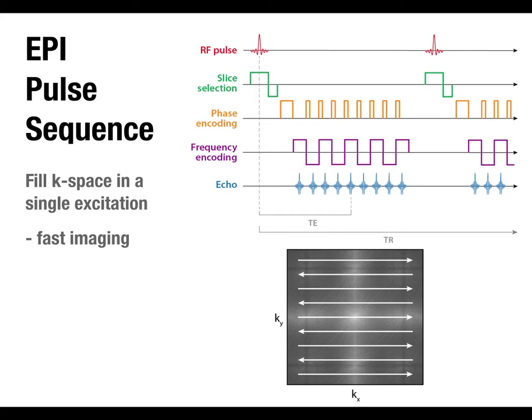With these EPI pulse sequences, if you ever have an fMRI scan, one thing they will tell you is don't put your hands together like this. That's because when you do that, you're creating a closed loop. And these rapidly switching gradients can actually induce an electrical current. Again, right-hand rule. It wouldn't probably be harmful, but you could feel peripheral nerve stimulation and tingling in your nerves because this rapid switching is going to induce these currents, and they're going to be flipping back and forth.